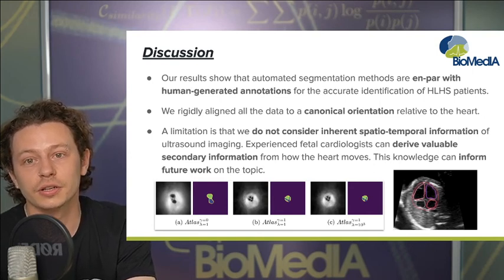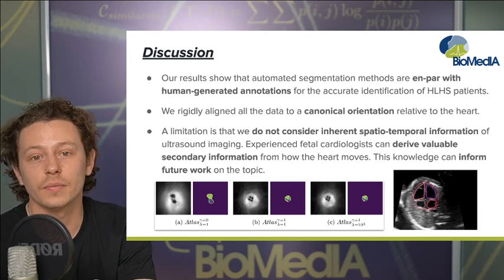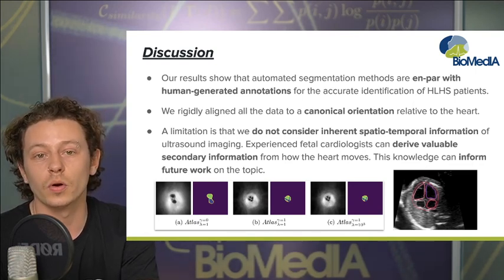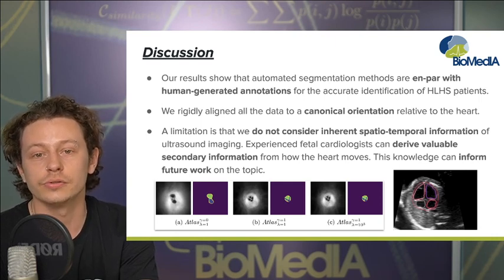Another limitation is that we do not consider the inherent spatiotemporal information of ultrasound imaging, where experienced fetal cardiologists can derive valuable secondary information from how the heart moves, and this knowledge can inform future work on the topic. Finally, in clinical practice, still images are common practice to report and document cases. Thus, a direct application to retrospective quality control and diagnosis support for primary care is in reach.